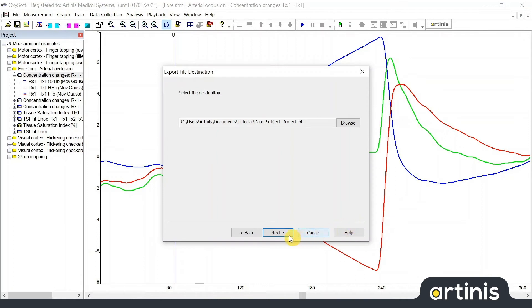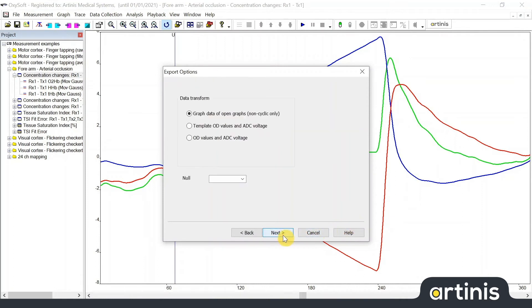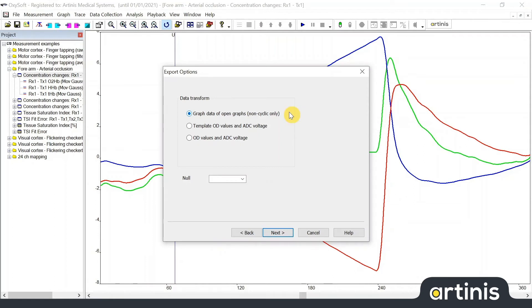In the next window we can choose which data is exported. This window will not be available when exporting to an old oxy or oxy3 file since raw data will be exported automatically.